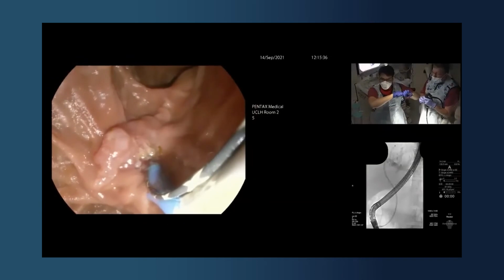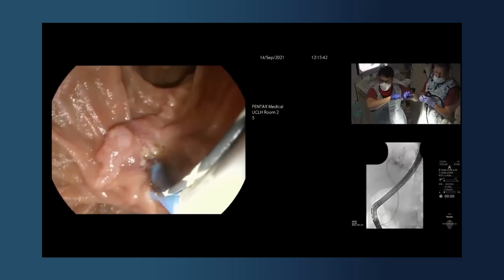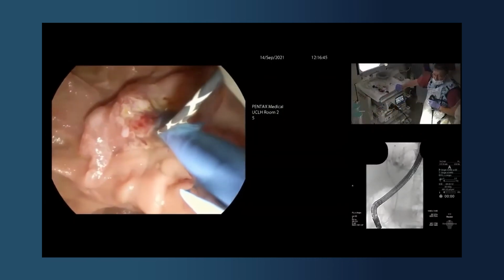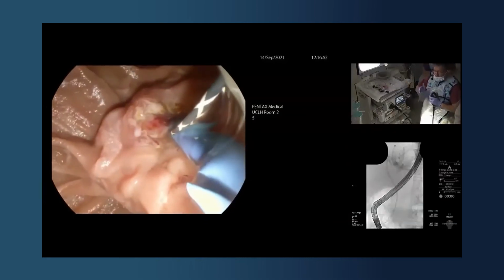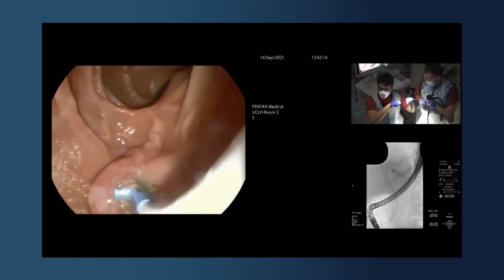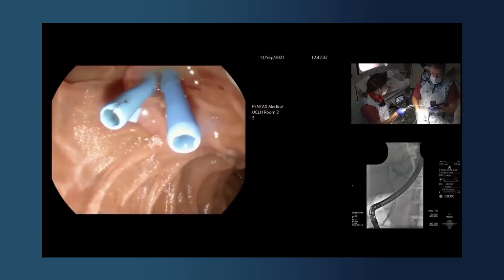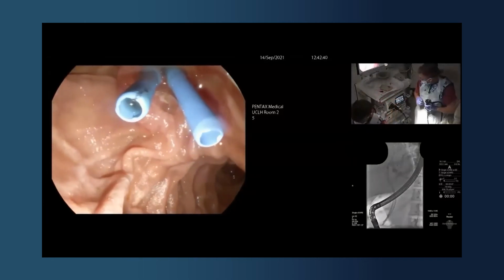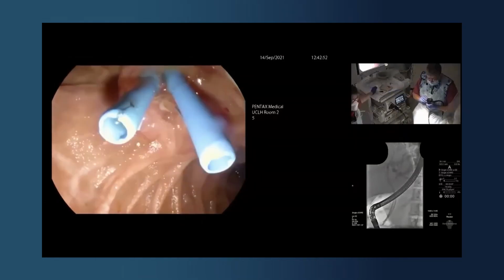And now you can just come back with the grey catheter, screen, and we'll deploy that stent. And there we are, the left. That's great. Now I'm hoping that the right-sided stent will be more straightforward. It usually is. Right anterior stents are usually more straightforward because you tend to be deploying the stent straight up rather than round the corner. Fabulous. And now you can ping out with your grey marker. Screen, please. Really nice. At the end, we've got both those stents in a nice position, nicely stenting left and right. We've had to use a lot of tricks there, but I think it makes the point that we've got technologies now that allow us to endoscopically, very carefully select the ducts that we need to get into.